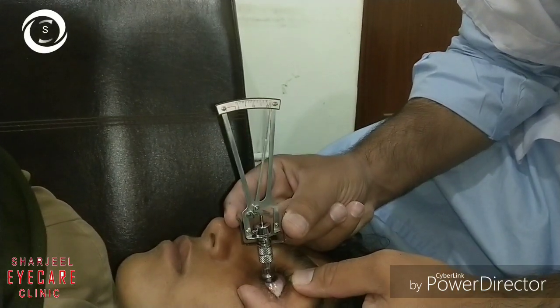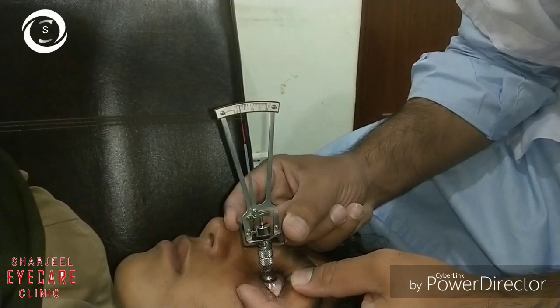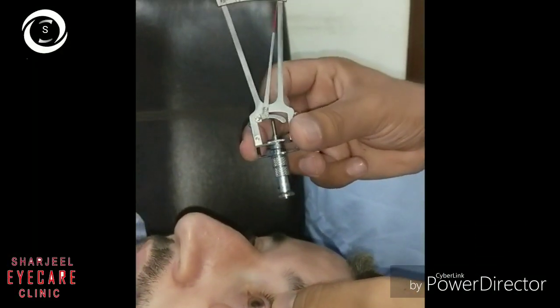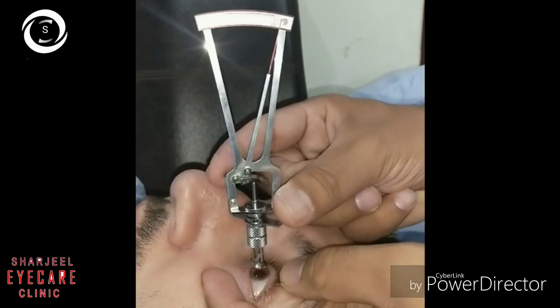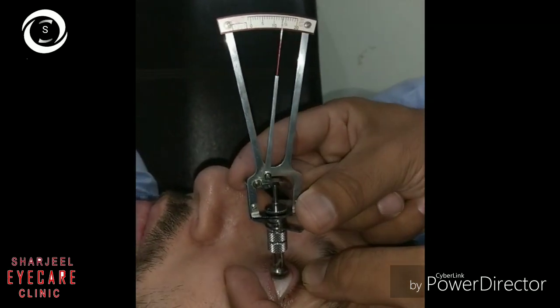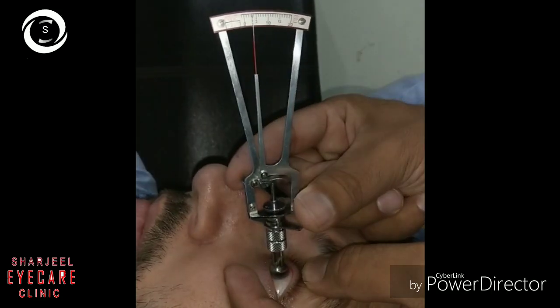With the 10-gram weight, the tonometer still showed a reading of three. This second patient had 50-plus intraocular pressure on the Schiotz indentation tonometry.